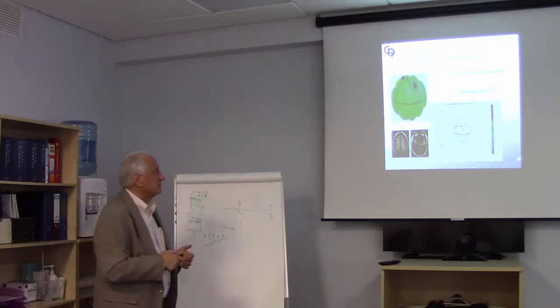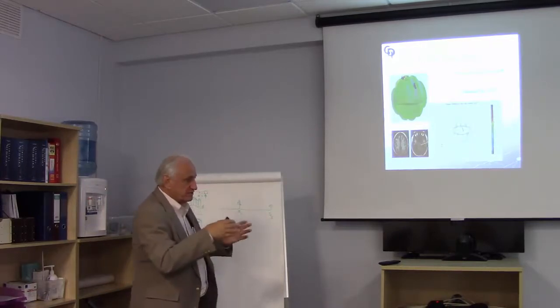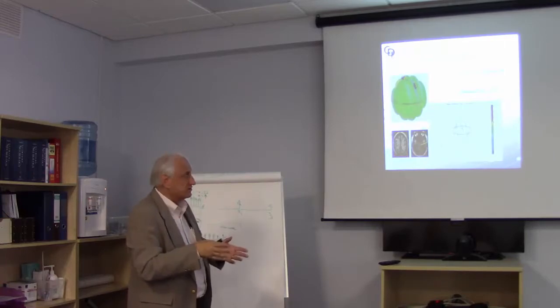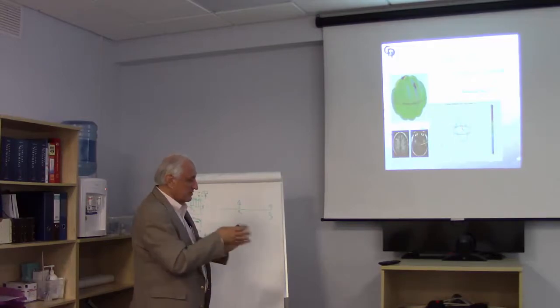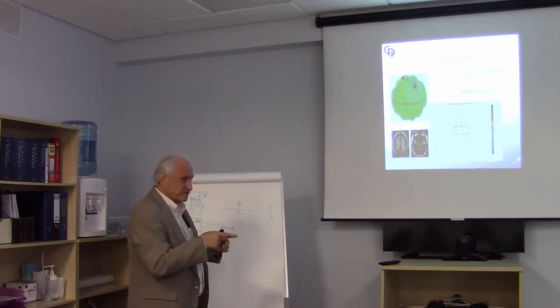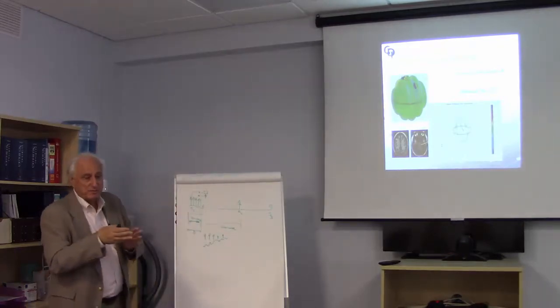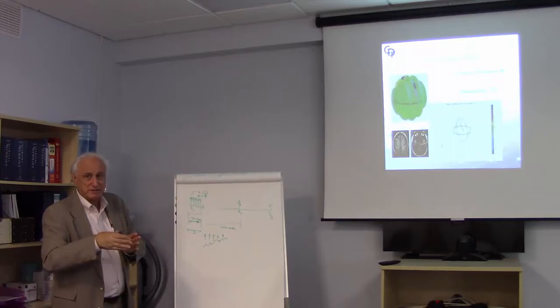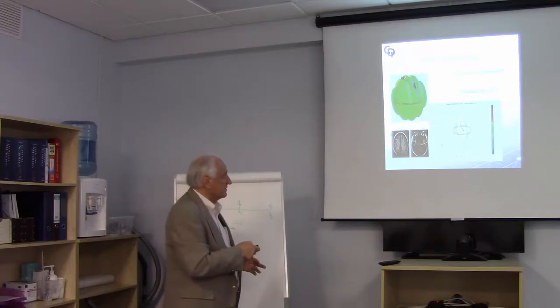That's a very hard thing to determine experimentally. So we built a computer model, and basically the model solved the equation that describes how these electric currents are distributed through the brain tissue. We got a tractogram of someone's corticospinal tract, one of the guys in the group, put that in the model, got it all aligned geometrically correctly, and then computed where the highest field strengths were. Remember we talked about the electric field strength. The point where it's highest is the point where you're most likely going to stimulate something. And it turned out that the highest points would not appear on the cortex.